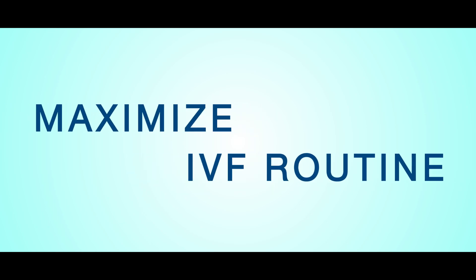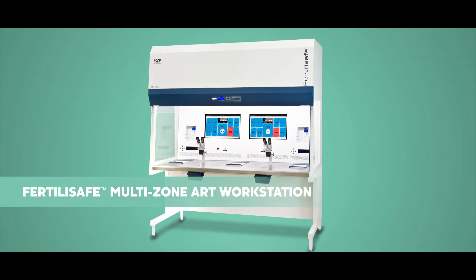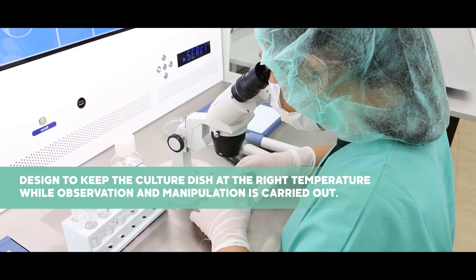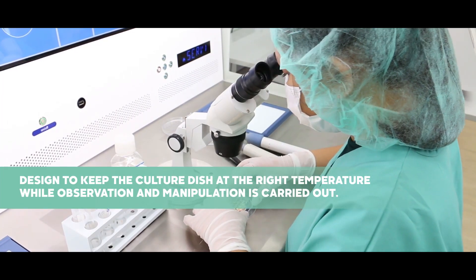Maximize every step in your IVF routine process with the new and improved Fertilisafe Multi-Zone Workstation. With multiple independent zones, it is designed to keep the culture dish at the right temperature while observation and manipulation is carried out.